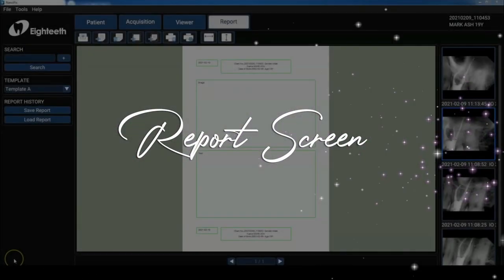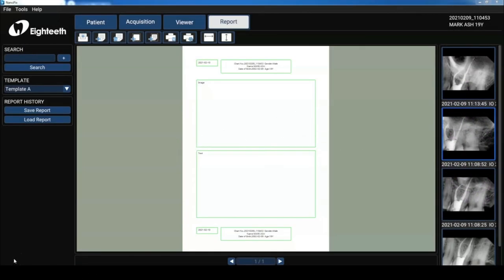In the report screen, we can create reports and automatically import our radiographs into that document. There are three different templates to choose from and I can customize the reports according to my needs.